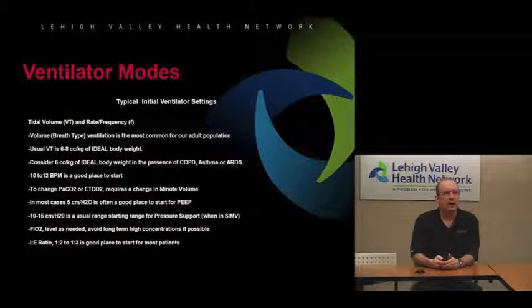Our FiO2 is a level as needed. We want to try to avoid using long-term high concentrations if possible. Just something to keep in mind: if somebody's on 100% FiO2 for as little as 5 to 6 hours, that could start to cause some alveolar damage.